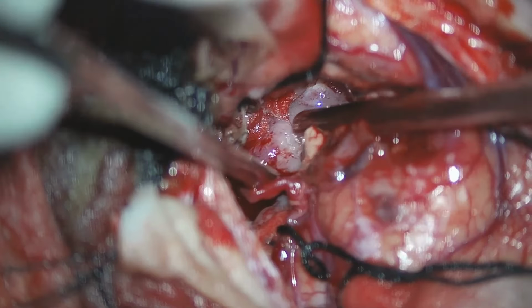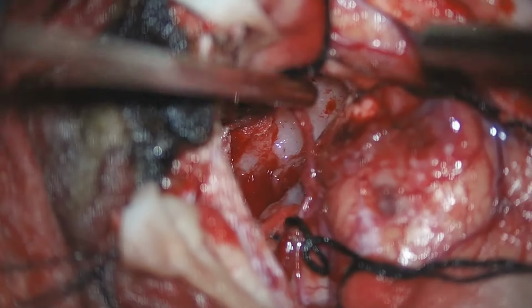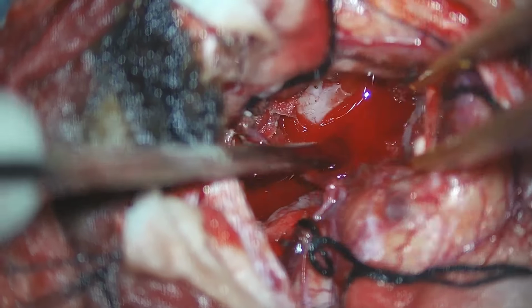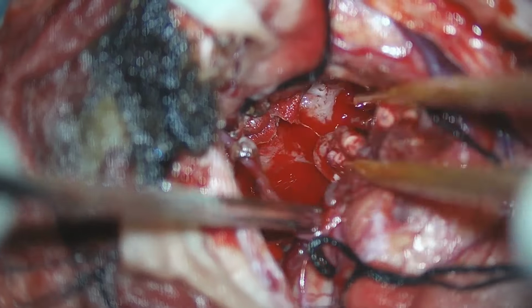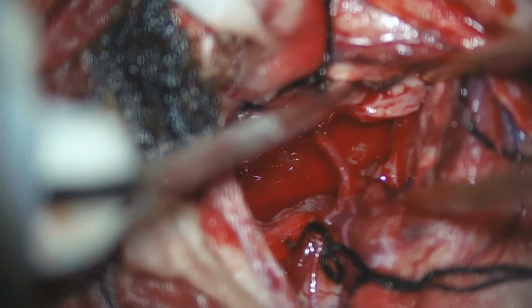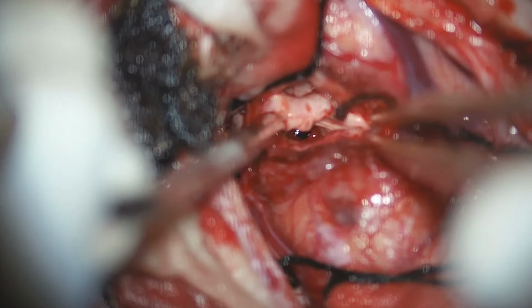Now we are removing the remaining part of the tumor that is on the lateral aspect and the superior aspect. Again, we will follow the tumor till its origin from the corpus callosum. Now we can see bits of normal brain from the lateral aspect being exposed, and we try to preserve as much normal brain as possible. As it is in the frontal lobe, we can also dissect a part of normal frontal lobe, as it gives a good margin of resection.